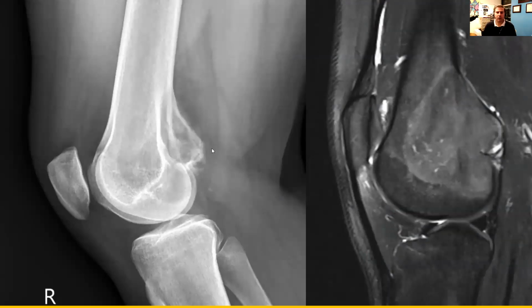Sagittal views were also reviewed, showing both a lytic and sclerotic mass that deforms the cortex and pushes on it posteriorly, distorting it. A similar feature was identified with advanced imaging. And you can see the intensity of the mass matches somewhat to the surrounding marrow as well as the cortex.